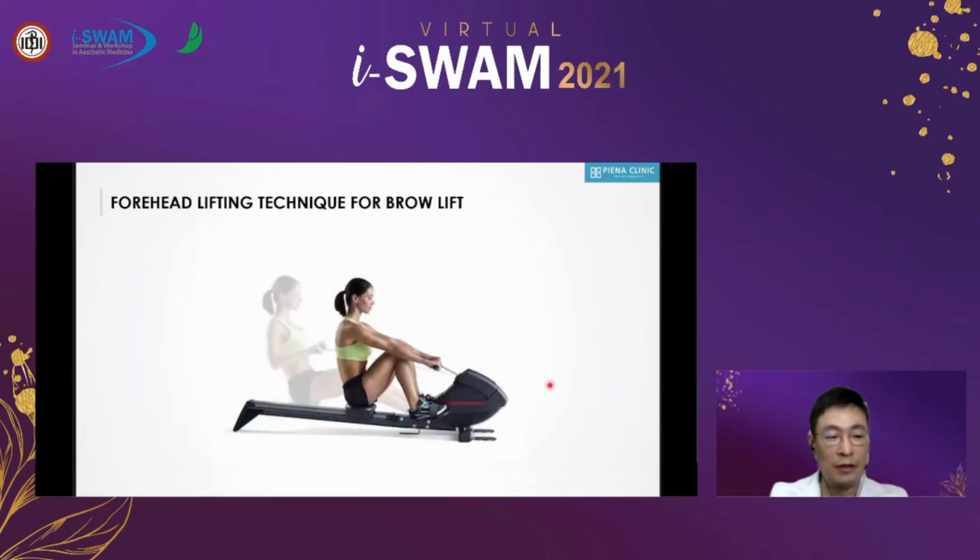And it is similar to the movement of the body by this fitness equipment. If you know about this equipment, when we pull this handle, your body will move up like in this direction. So this part will be the moving point, will be the eyebrow, and the fixing point will be the periosteum. So I'm explaining why the reverse insertion technique is useful when lifting eyebrows.